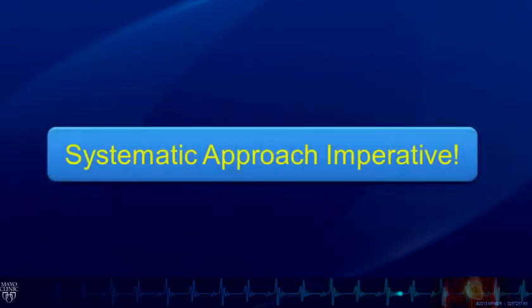In summary, echocardiography remains the primary imaging tool for most patients with congenital heart disease. And it is imperative to remember that the systematic approach provides clear assessment of even the most complex patient in most circumstances. Thank you.